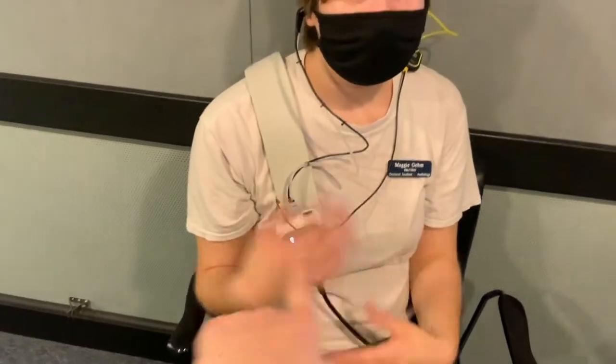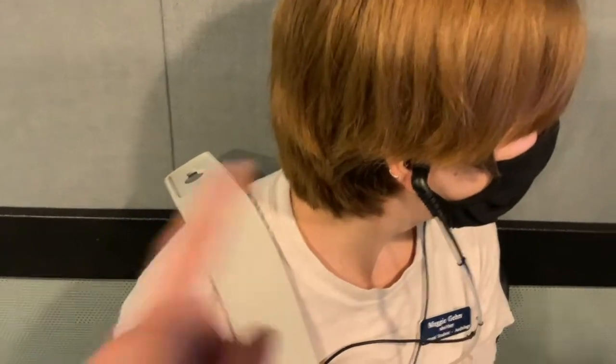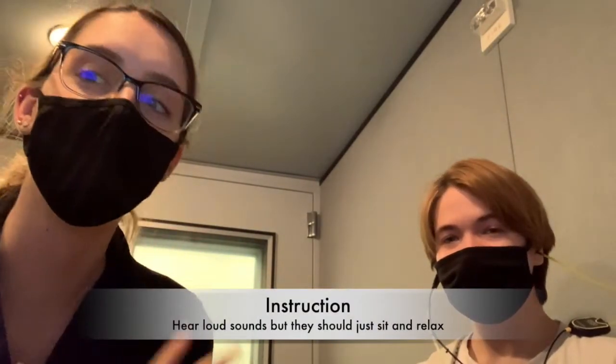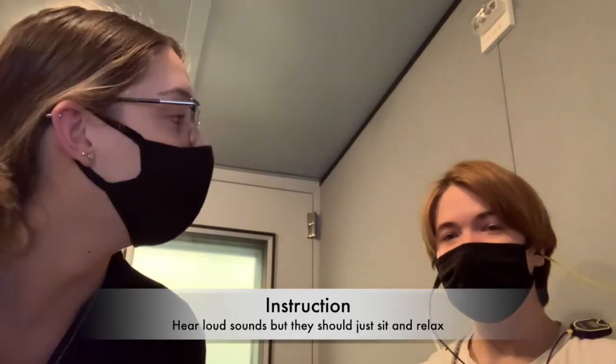So here's the setup for acoustic reflex thresholds. We're using the same machine as we use for tympanometry, and as you can see, the probe is in her right ear, which would be the right ipsilateral. When we want to do contralateral testing, we would put the stimulus into her left ear, but it'd still be recorded in the right ear. Once you have your patient all set up, you're going to want to instruct them that they are going to hear some loud sounds. It may be a little uncomfortable, but nothing's going to hurt at all.